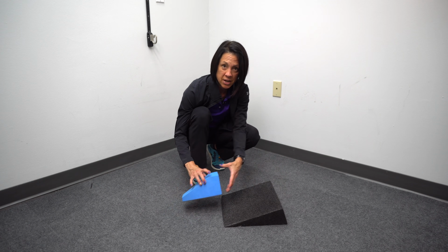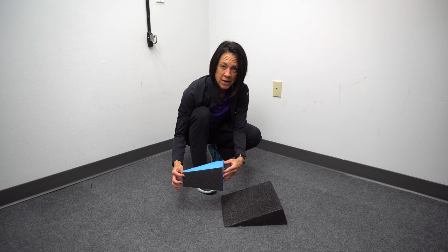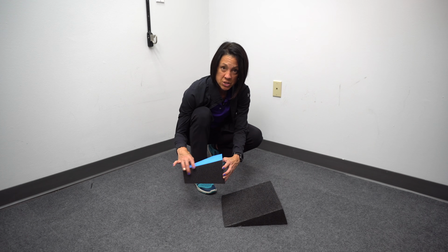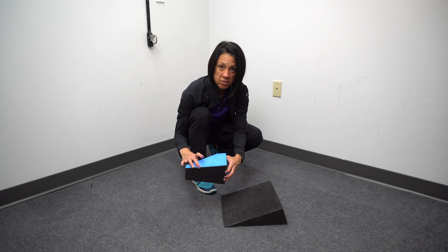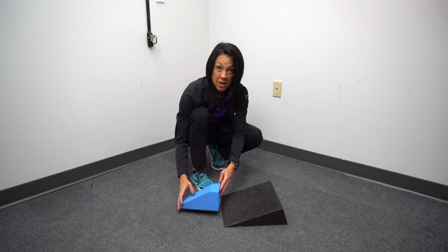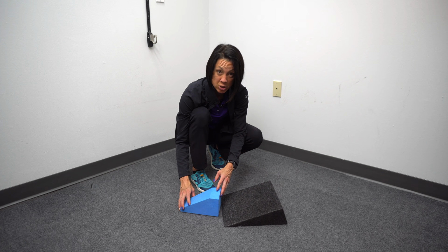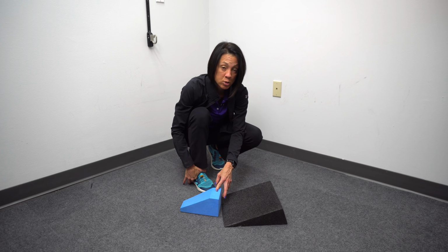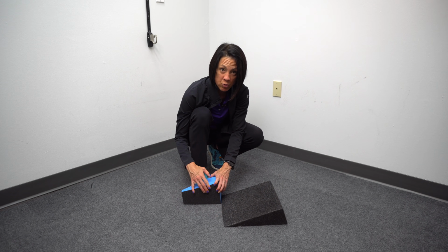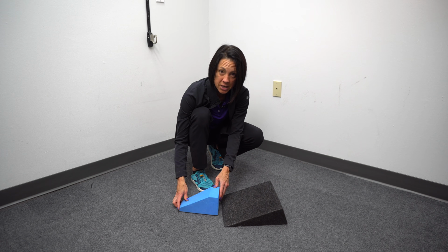Now, the other wedge I have here, which I don't show as much for self-stretching, is this wedge here. The thing I like about this wedge is it does have rubber on the bottom. Now, I've done a whole video on this, and I will link it in the video description below, where I talk about how caregivers might be able to help someone stretch by doing some kind of ankle joint mobilizations. And that's what I really like this wedge for, because it has a rubber bottom on it. It doesn't slide as much.